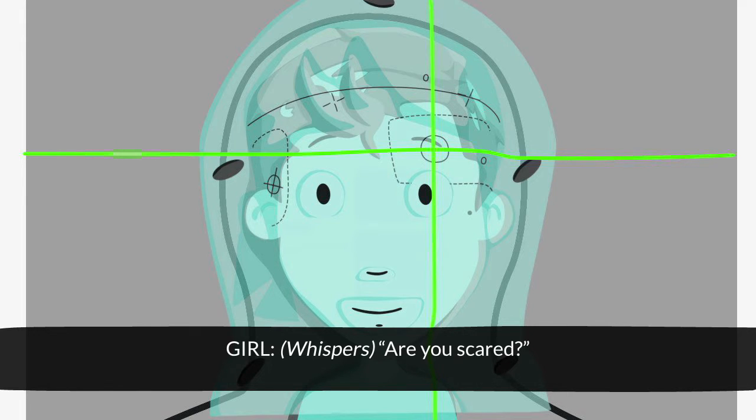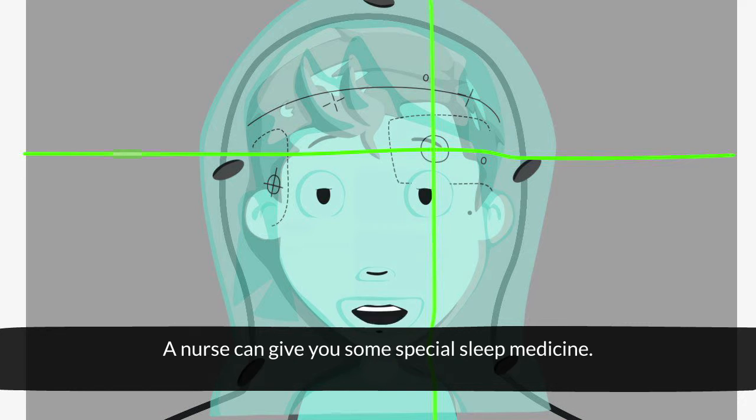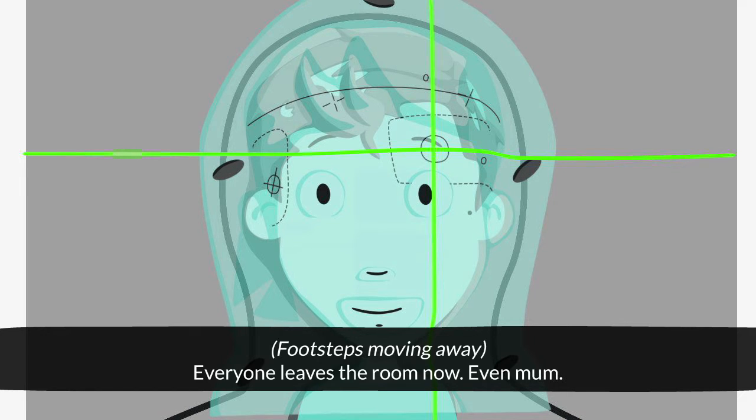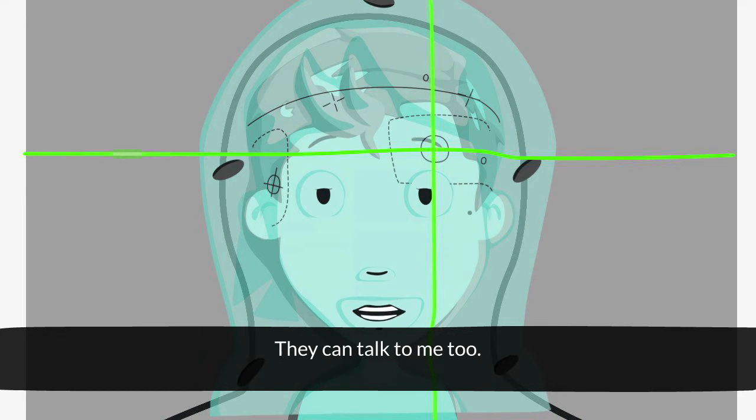Are you scared? I was at first, but now I'm not. If you are scared, tell someone — a nurse can give you some special sleep medicine. Okay Jake, we're lined up. Remember to stay nice and still. Okay. Everyone leaves the room now, even Mum. They can see and hear me in the other room. They can talk to me, too.